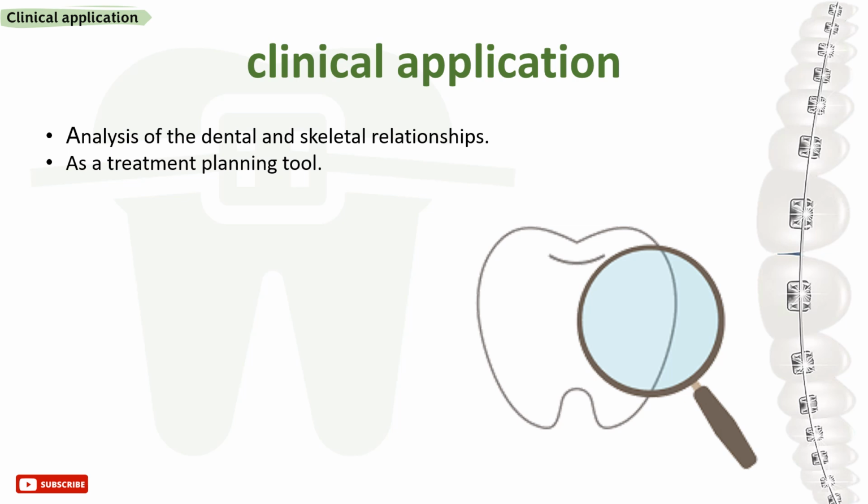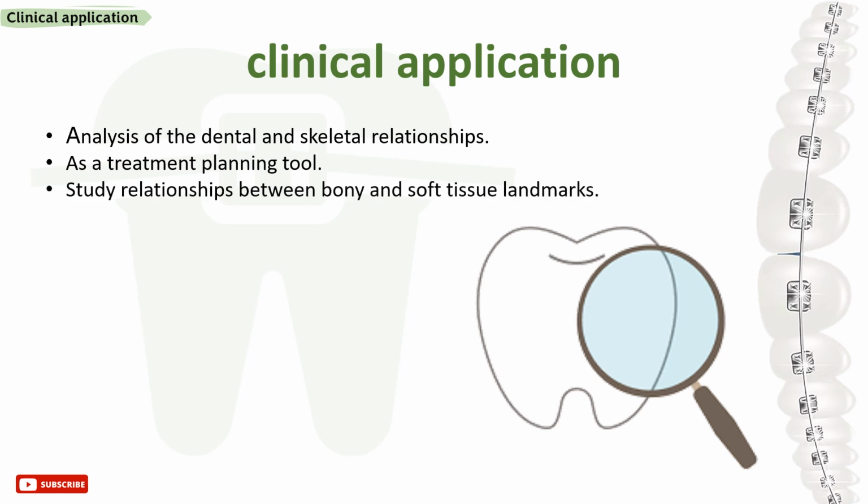It can be used to study the relationships between bony and soft tissue landmarks and to diagnose the facial growth abnormalities prior to the treatment, also in the middle of the treatment to evaluate the progress, and at the conclusion of the treatment to ascertain that the goals of the treatment have been met.